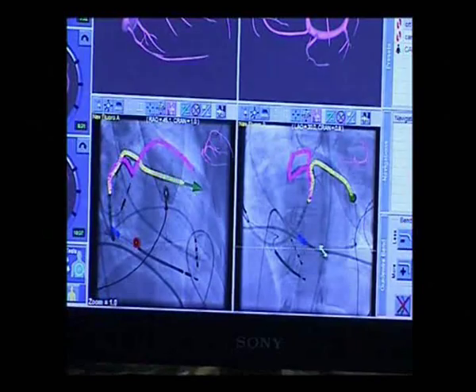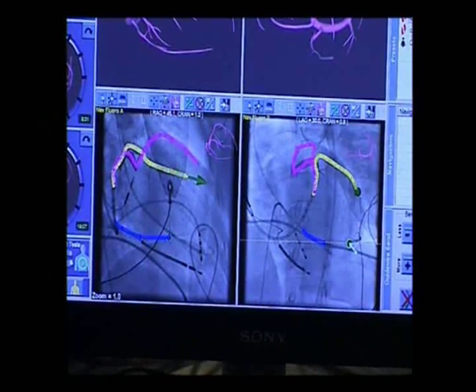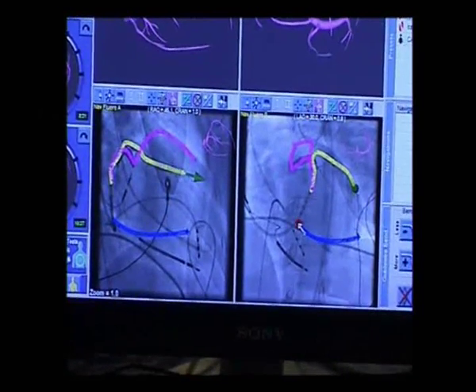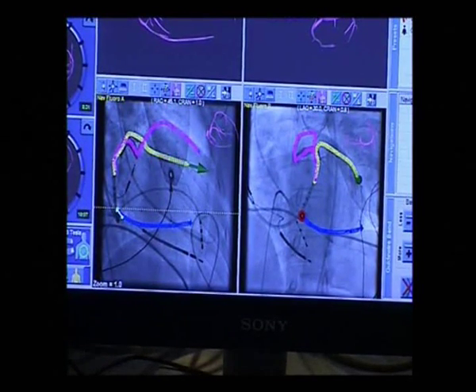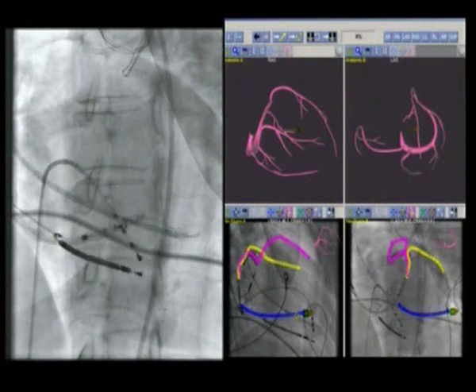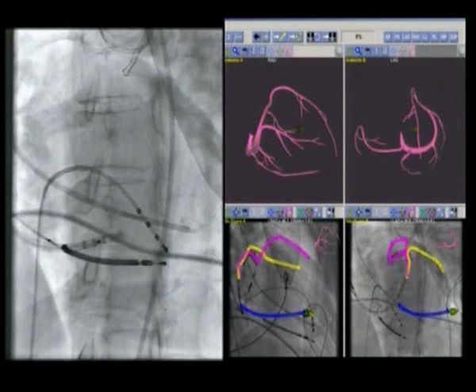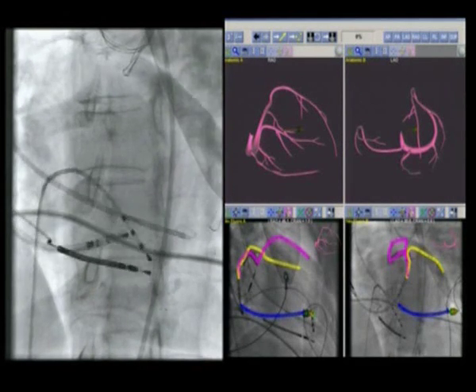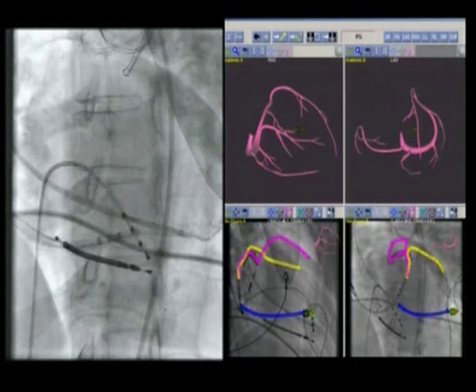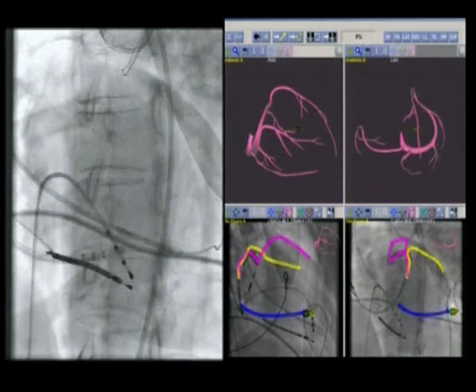Although the first targeted branch showed a marked improvement of both dyssynchrony and hemodynamic parameters, we want to test pacing from other vessels. Here we are constructing the 3D vessel roadmap in blue of the posterior branch of the coronary sinus with the Stereotaxis system. We are now navigating the magnetic guide wire into the coronary sinus branch. There are multiple reasons for difficult left ventricular lead implants which may be overcome by the Stereotaxis system. In this case, difficulties included absence of adequate veins, difficult vein takeoffs, tortuous branch veins, and early takeoff of left ventricle lead branches. The branch is successfully cannulated by the magnetic guide wire and the lead is pushed to reach the position of the magnetic tip.